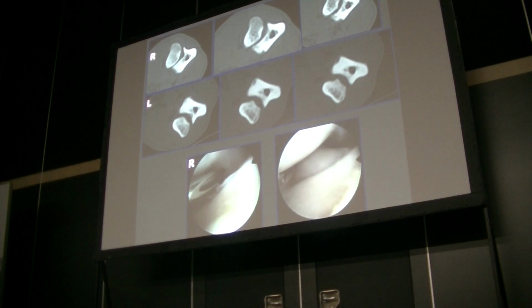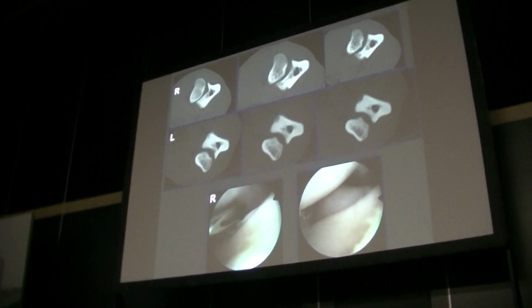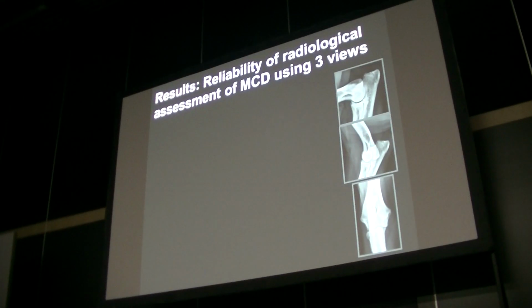Then the arthroscopic findings: the arthroscopist was able to insert the scope in such a small joint. The finding was that in the right elbow there was a normal coronoid process. So the conclusion, of course, is this is a very atypical breed that we missed on CT.